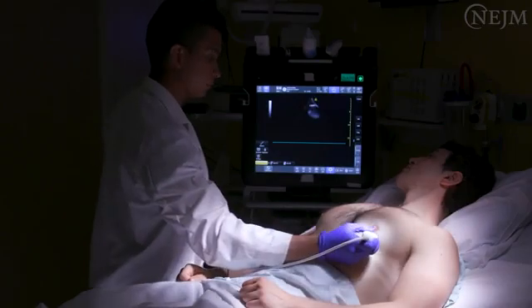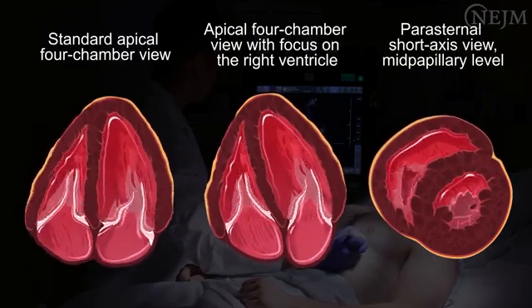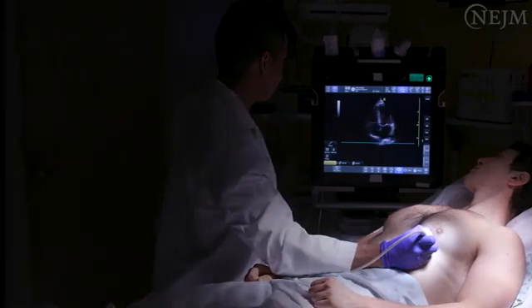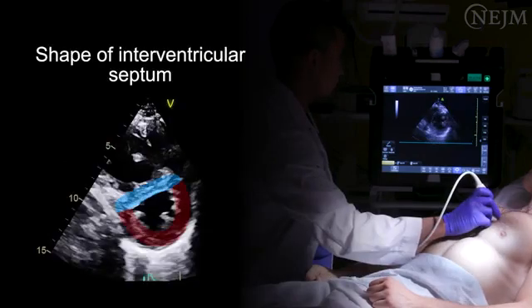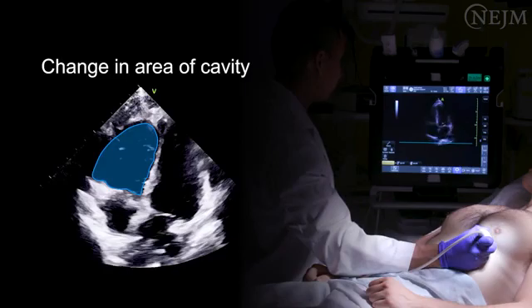In patients with suspected or known cardiovascular or pulmonary disease, focused cardiac ultrasonography can be used to evaluate right ventricular size and systolic function on the basis of 4 measures: cavity size of the right ventricle relative to that of the left ventricle, shape of the interventricular septum, longitudinal shortening, and change in the area of the cavity.